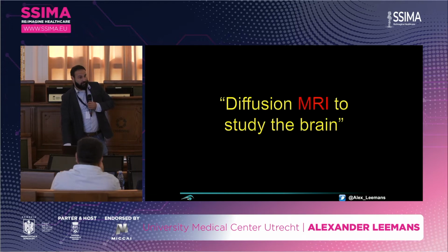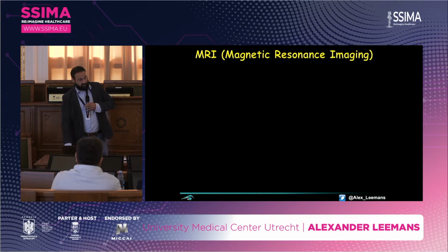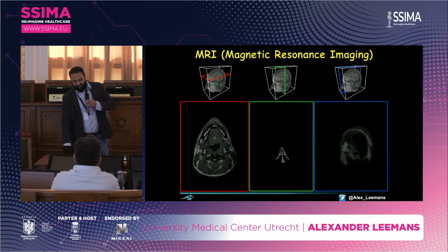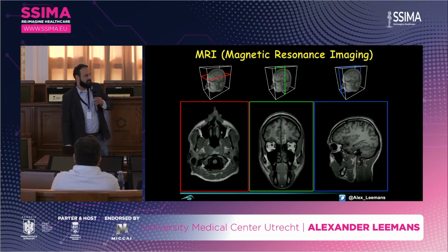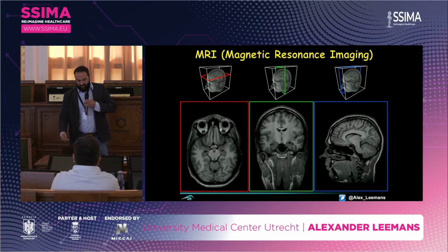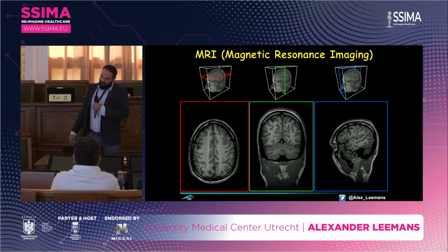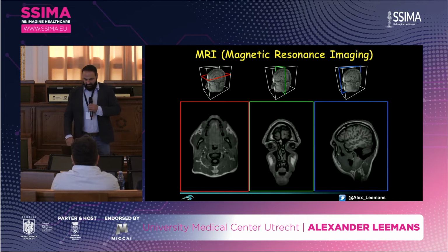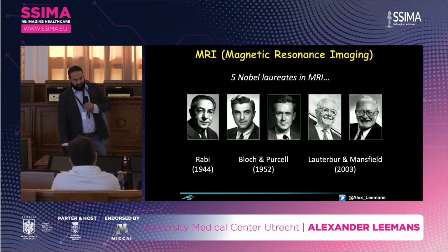MRI, I hope we're all familiar with MRI. If not, here's my 3 slides on MRI. Well, you've got this big machine, you lie in, and then you can scan the internals of your body, right? So in this case, looking at these images, we're looking at the relaxation properties of induced tissue magnetization. And the cool thing is that already 5 Nobel laureates have been involved in this work. So, pretty important stuff.